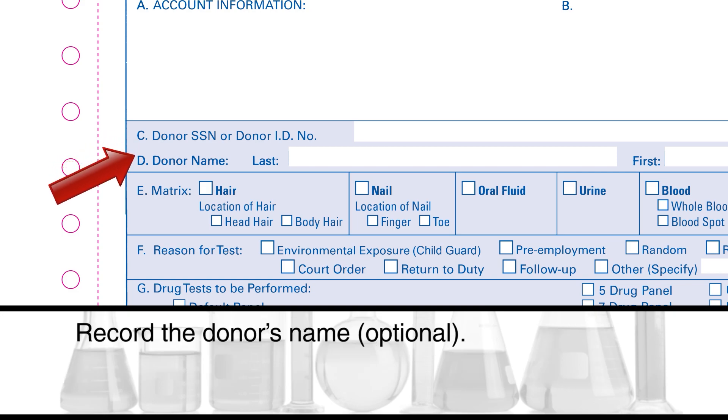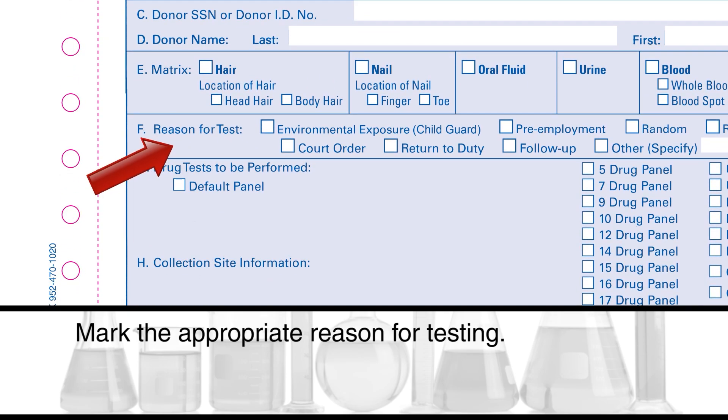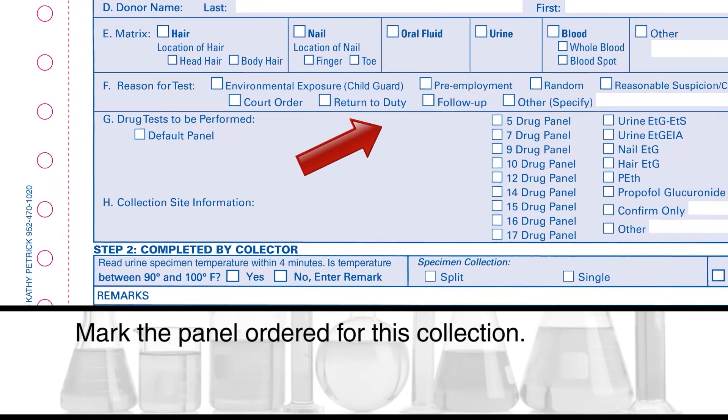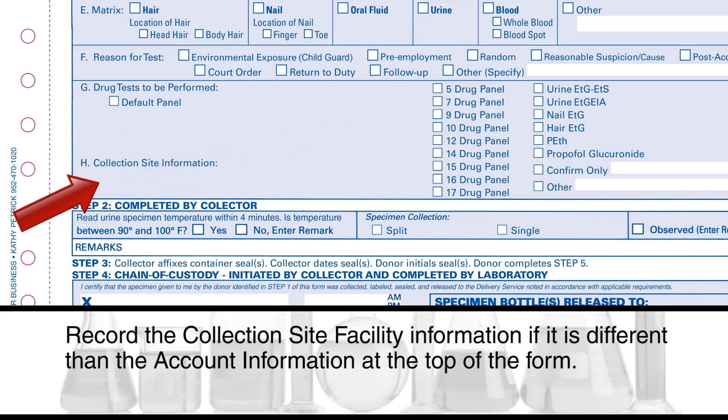Record the donor's name. Mark the specimen matrix and location. Mark the appropriate reason for testing. Mark the panel ordered for this collection. Record the collection site facility information if it is different than the account information at the top of the form.